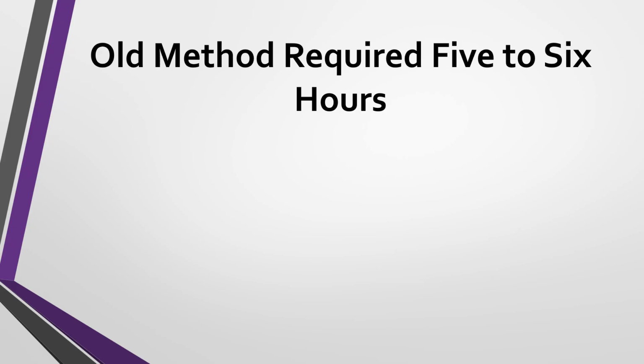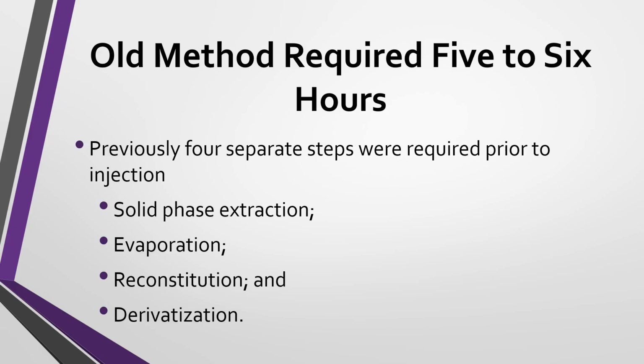The old method required 5 to 6 hours. Previously, 4 separate steps were required prior to injection into the GC-MS instrument: solid phase extraction, evaporation, reconstitution, and derivatization. All of these took 5 to 6 hours to complete one batch of the samples you were running.